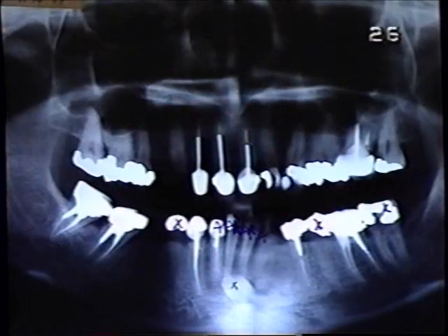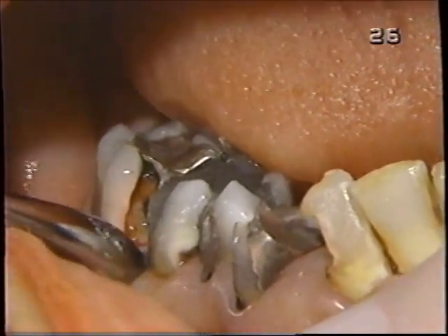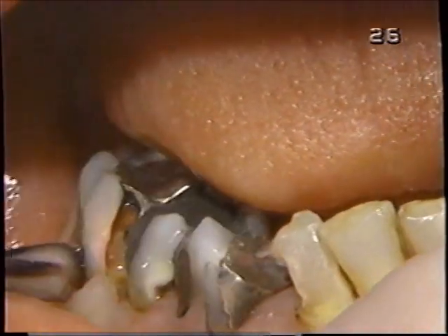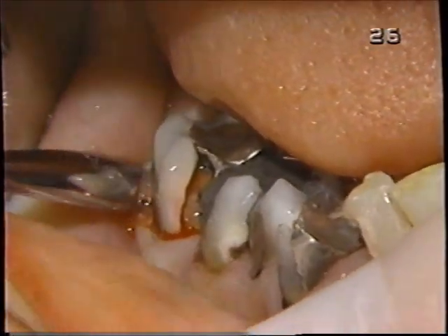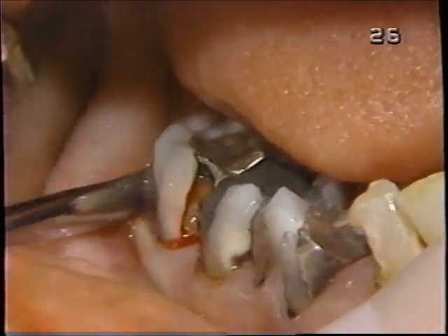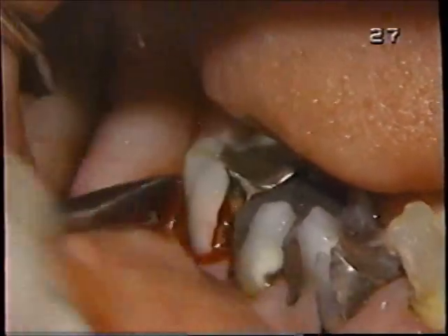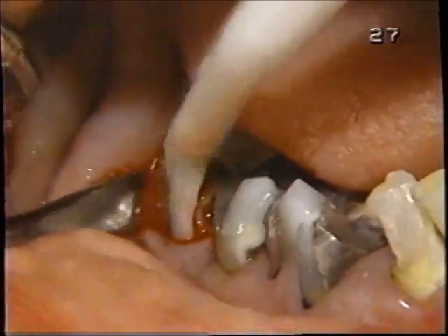Now, with the patient hopefully anesthetized, what we're going to do is reflect a cervical flap. Now keep in mind, we're going to retain number 30. So we want to do just a modest cervical reflection around 31 here. And then on the lingual as well.